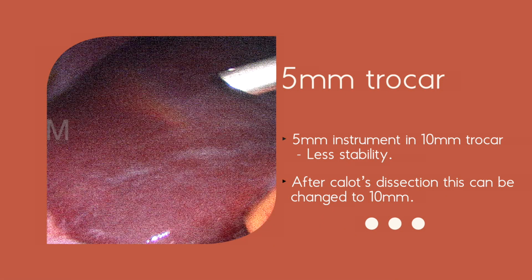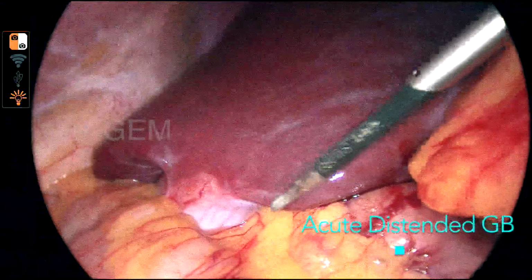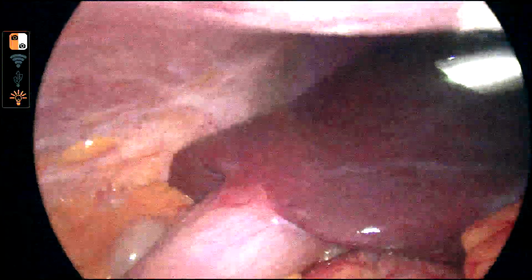After the Calot's dissection is completed, which is a very critical thing in lap chole, once the Calot's dissection is completed, then I make it 10 mm for a clip. So, now you can see the acute edematous cholecystitis.